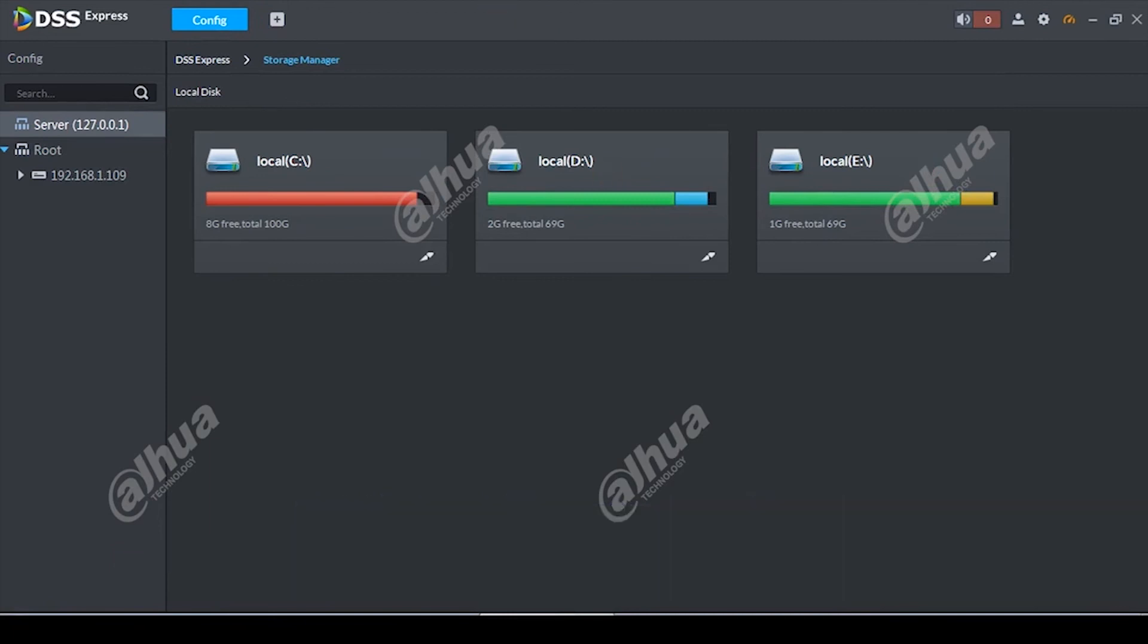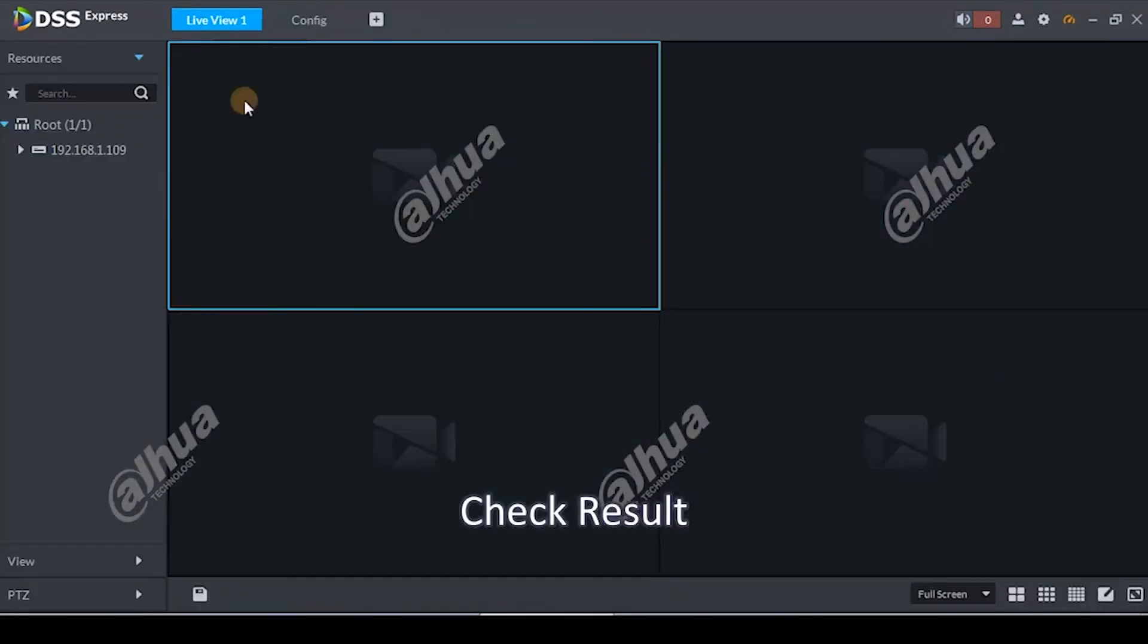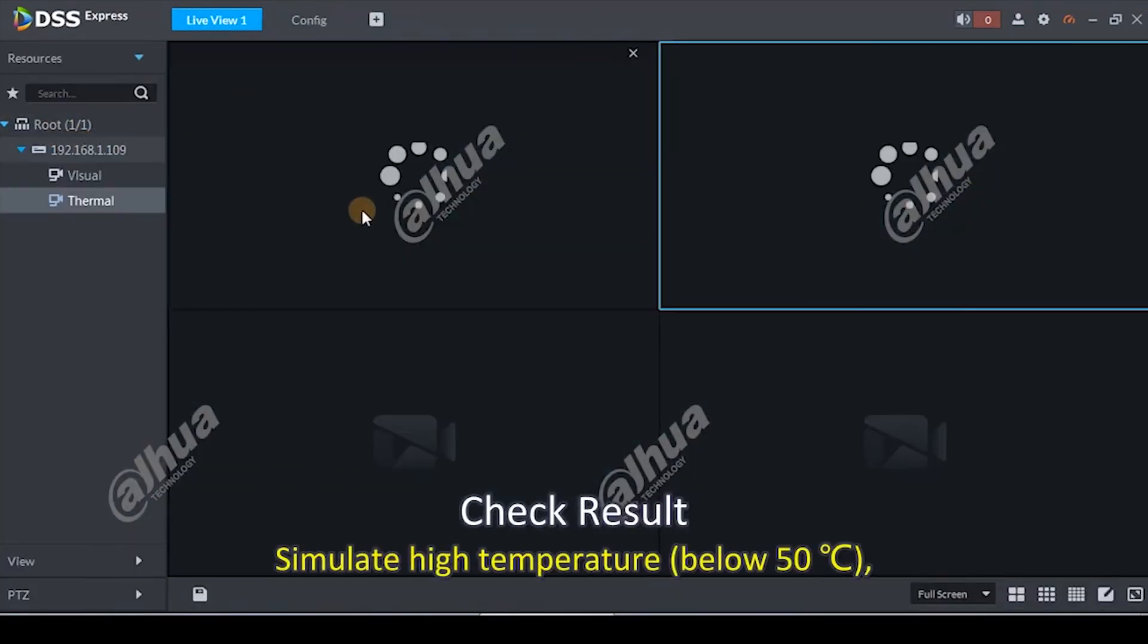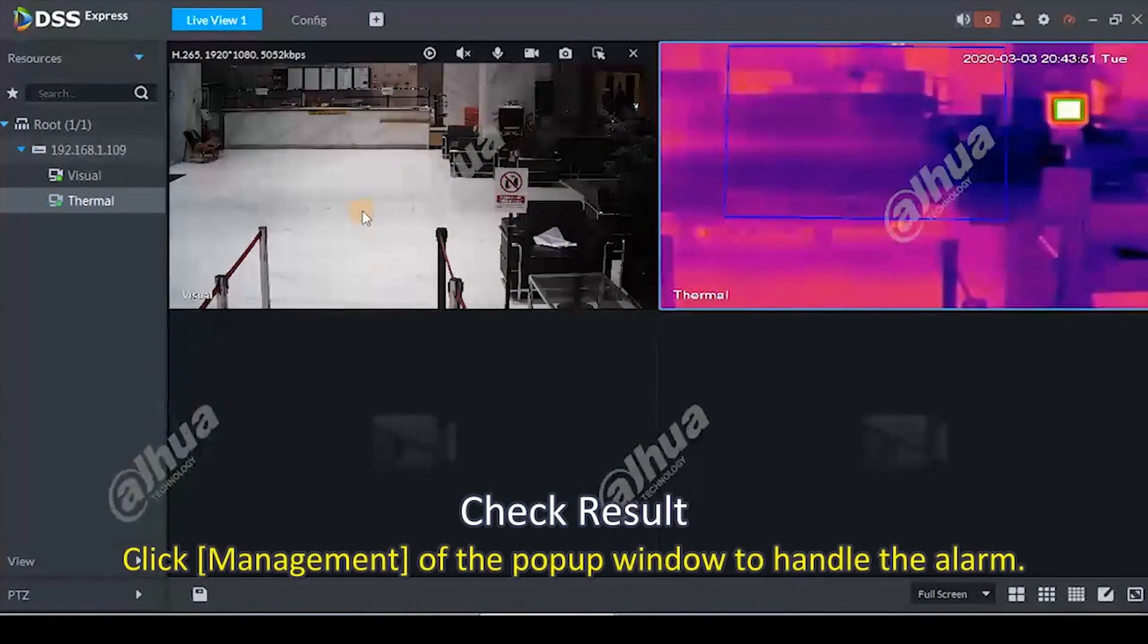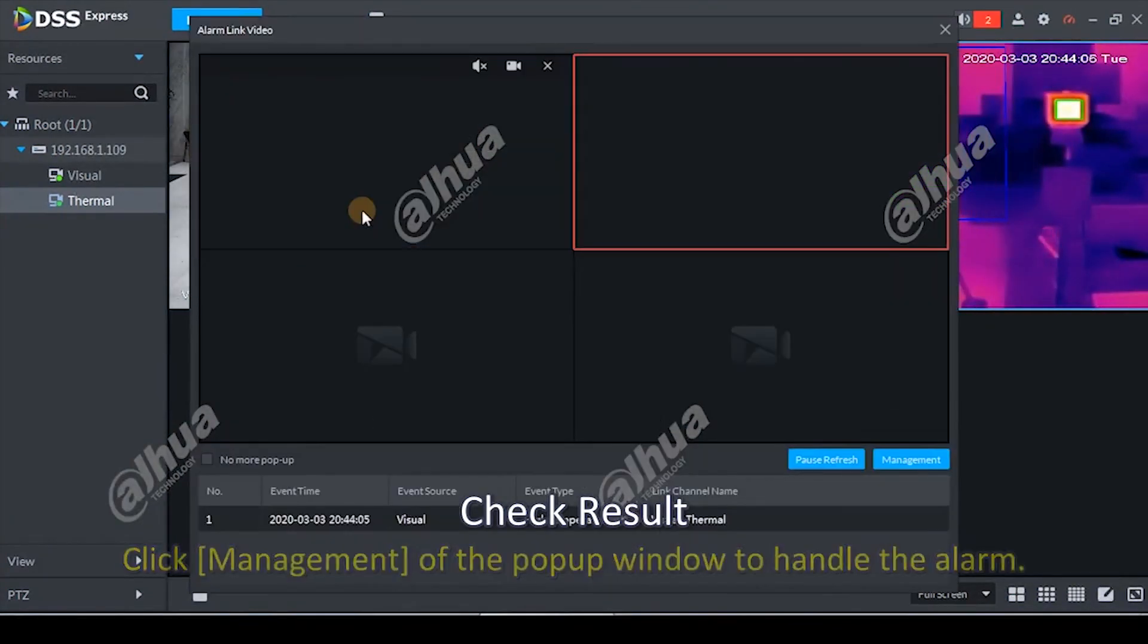Check result. Simulate high temperature below 50 degrees. Check the result and the popup alarm window.